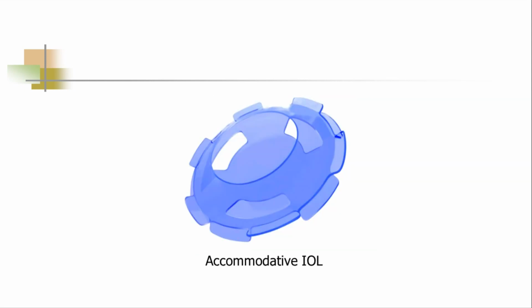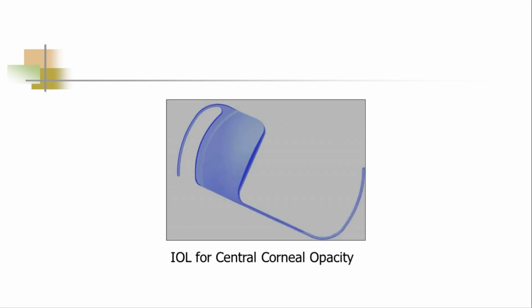And then we have so many specialized posterior chamber IOLs. The accommodative IOL is the first one that I will show you. An accommodative IOL is a two-element lens. Each element is shaped like a saucer and is designed to fit snugly in the bag. In this, the dioptric carrier is implanted first and the second portion, bag maintainer, is implanted later. This holds the bag open and prevents shrinkage due to fibrosis of the capsular bag around the optic portion.